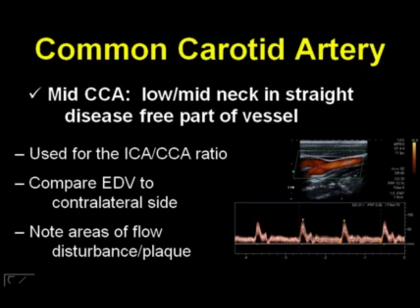For instance, the absence of diastolic flow ipsilaterally really should clue you into the possibility that there may be something going on distally. On the other hand, if you're looking at a parvus tardus waveform where you have decreased velocities on one side versus the other, you have to start thinking about the possibility of more proximal disease.